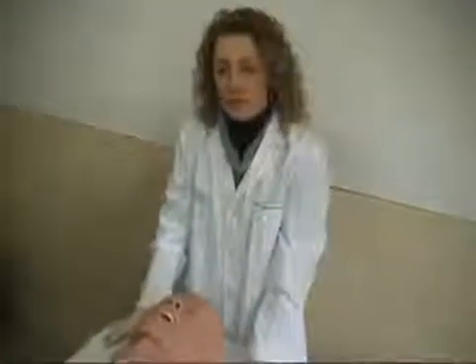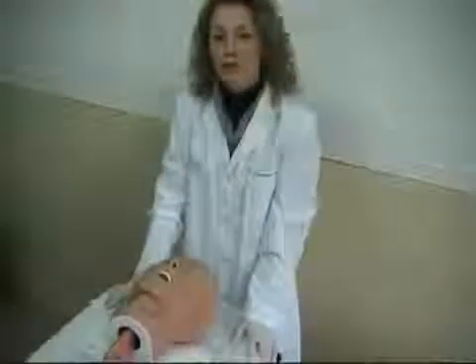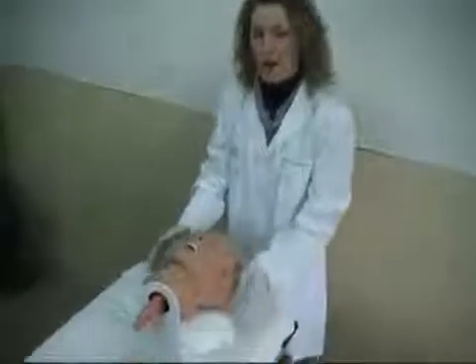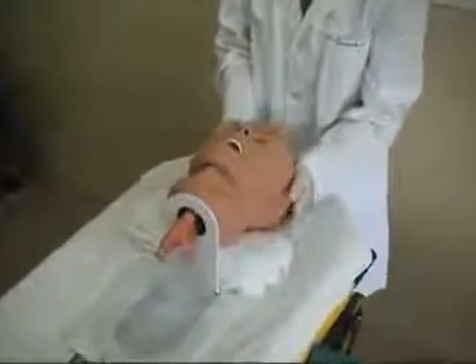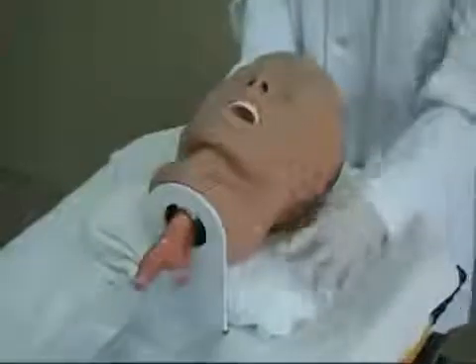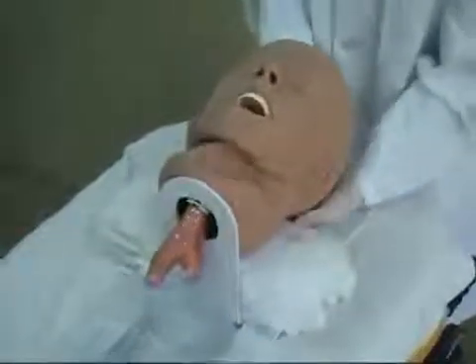In addition, the student should have a general overview of the procedure used in orotracheal intubation, because this will enable them to help the operator properly. This procedure includes the following key points. Standing behind the patient, place the patient's head into the sniffing position by placing a pillow or a folded towel under the patient's neck.